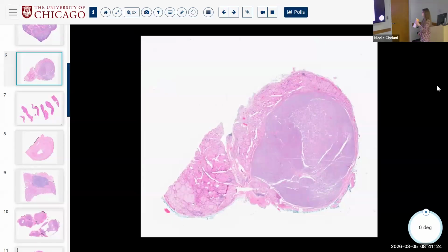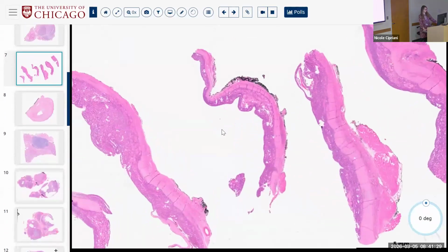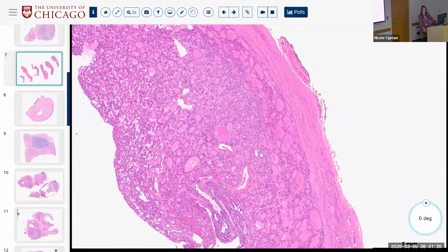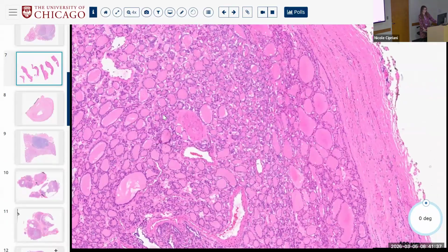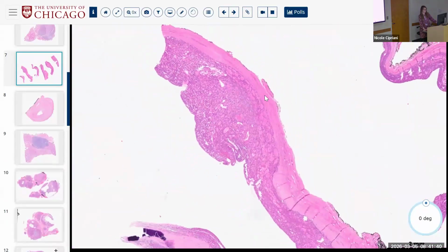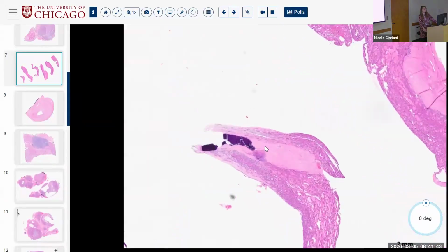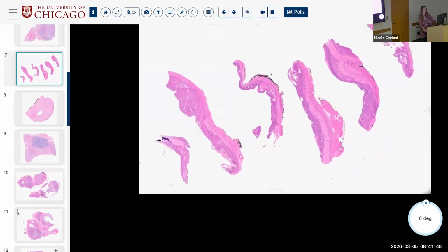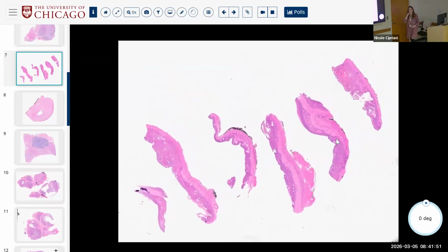Okay. All right, next. Low power growth pattern. Follicular. Capsule with coarse capsular calx. So kind of eggshelly. In this case, this is another outside consult. They did a nice thing, right, where they did multiple strips of capsule on the same slide so we can evaluate it. I don't know why some of it is a little bit like foldy and wonky.